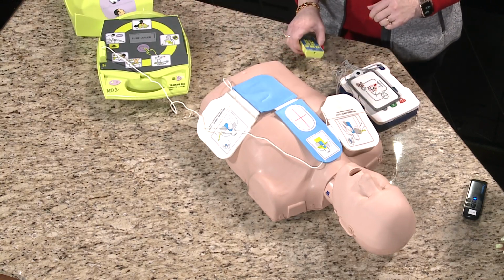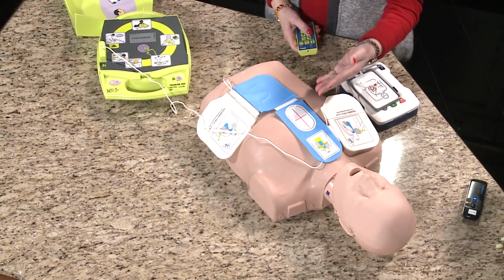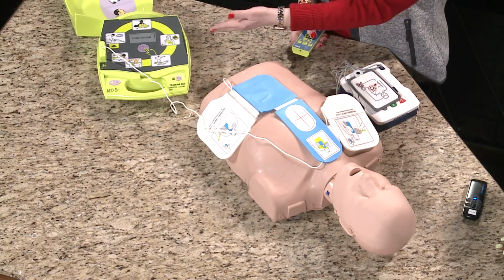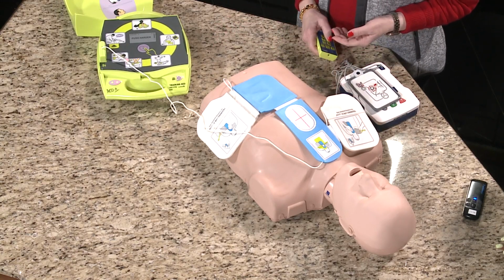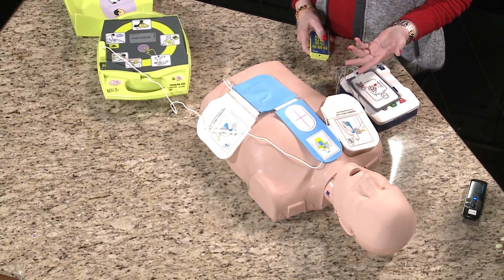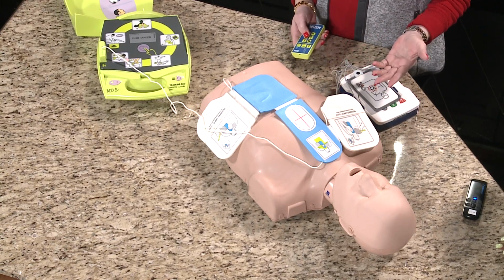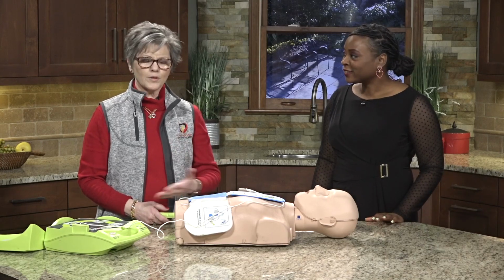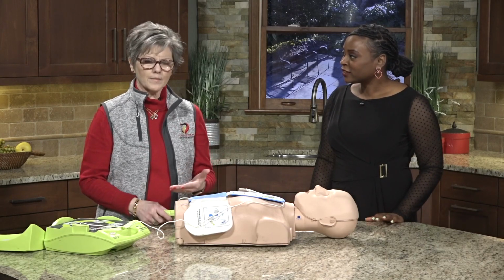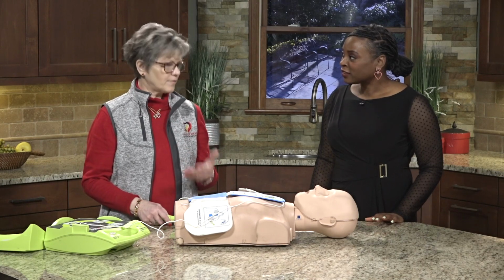Shock delivered. Start CPR. You will go right back to CPR, and it gives you a beat to go to. Some of them will say something like, push harder, you need to go harder. Or if you're doing really great compressions, it's going to say good compression. Okay. So you can't mess it up. You continue following this beep until it comes back on and says analyzing.